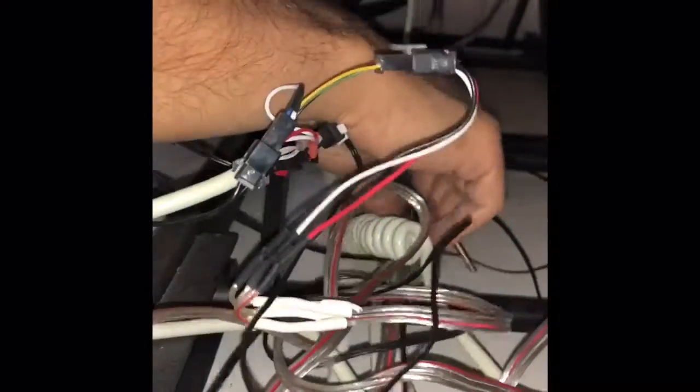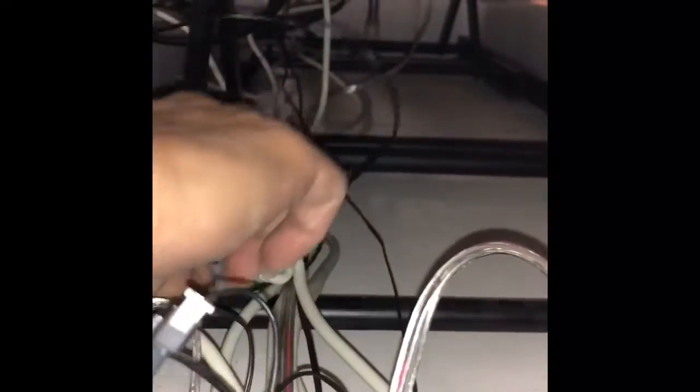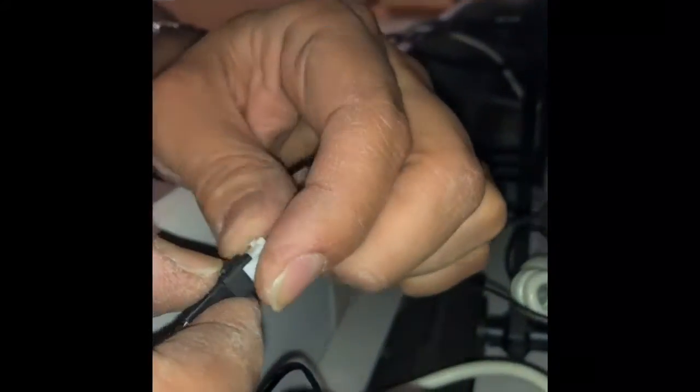And once that is found, you just wanna make sure you are looking for the correct wire, and do not lose the wire once you grab it from the top, because it's just going to be a little bit difficult to go out and find. There's too many wires going on here. But once that wire is pretty much traced down, it's going to get connected to a female part, male and a female, which is going to be black and white.